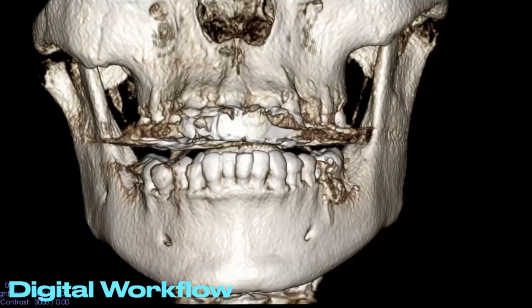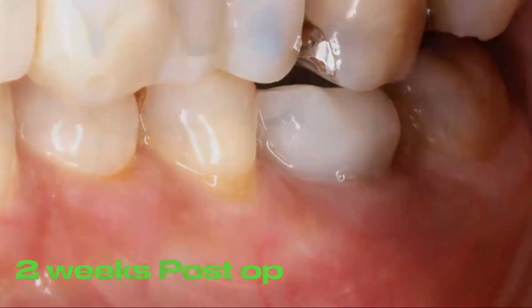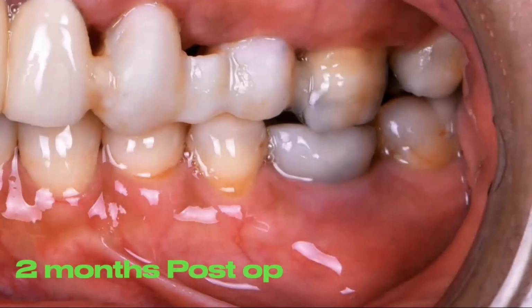And so that allows us to take a look at a lot of things, allows us to visualize where the mental foramen is, where everything else is as well, and really allows us to do a really good job. And so when we do all that and we spend all that time, the case can look like that at 2 weeks post-op. And then at 2 months post-op, it looks pretty darn good. We've got a good gingival zenith. We've got a good band of keratinized tissue where the patient's super duper healthy. They've had a tooth since the beginning.